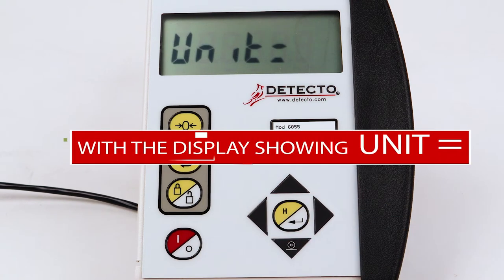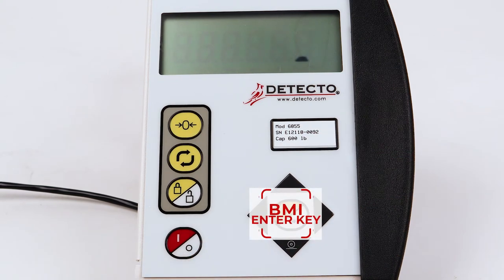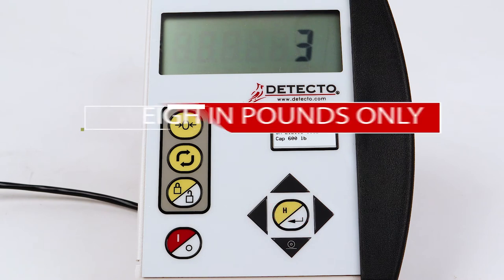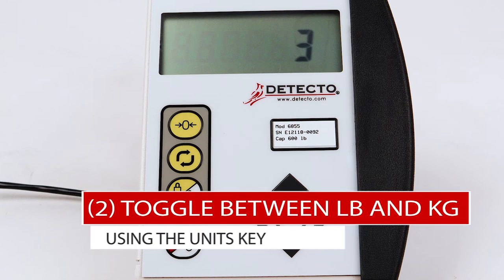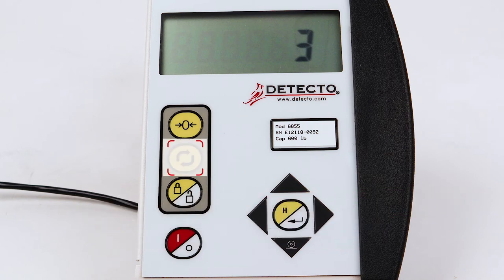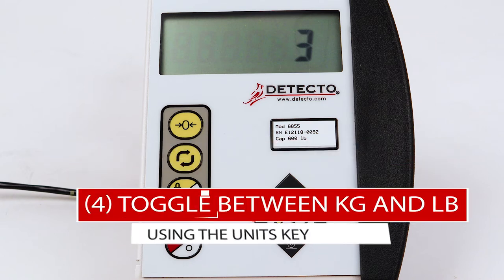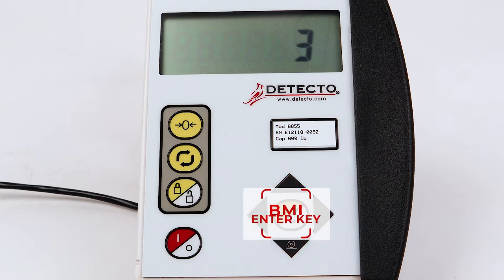With the display showing UNIT equal for the weighing units setting, press the BMI Enter key to show the current setting. If the current setting is correct — 1 to weigh in pounds only, 2 to toggle between pounds and kilograms using the units key, 3 to weigh in kilograms only, or 4 to toggle between kilograms and pounds using the units key — press the BMI Enter key. Otherwise, press the up or down arrow keys to select the correct weighing units and press the BMI Enter key.